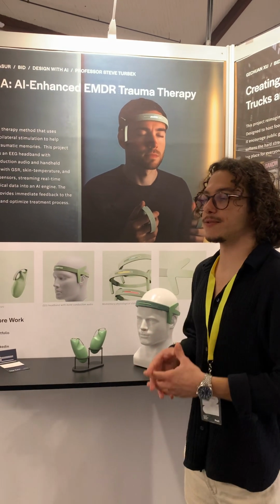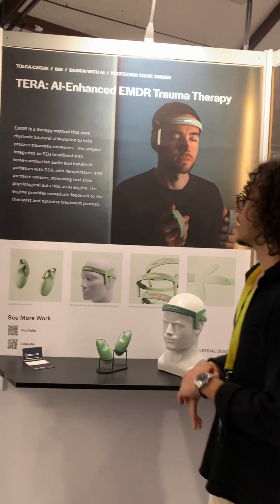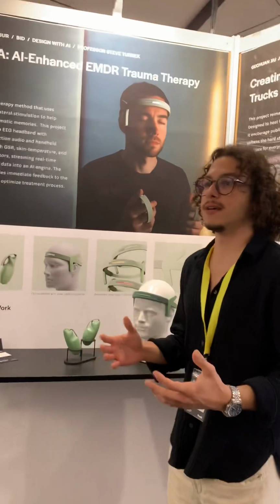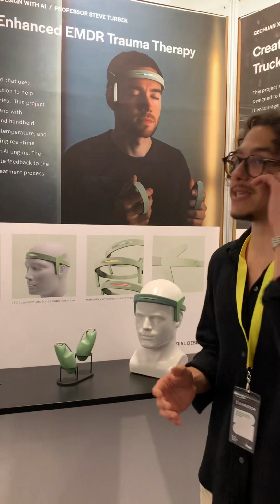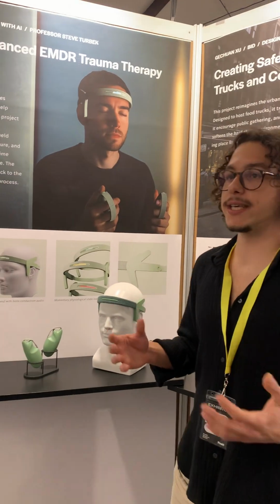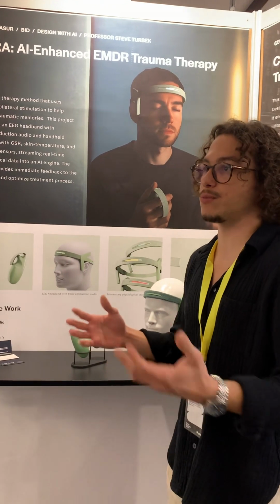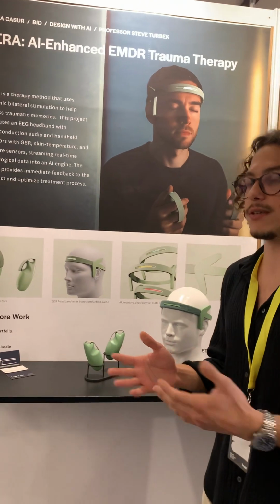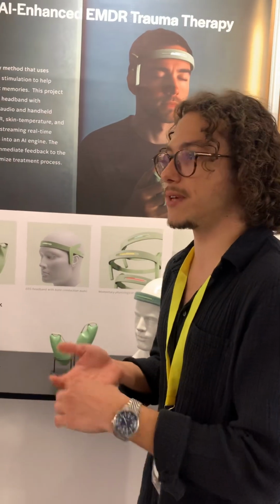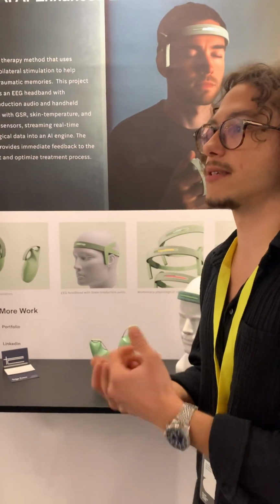I'm designing a specific device for the EMDR therapy method, which is used for reprocessing traumatic memories, especially with patients that have PTSD problems. What it does is allow patients to reprocess their memories through bilateral stimulation, which is accomplished through either sensory, visual, or auditory feedback. I focus my project on both auditory and sensory feedback.